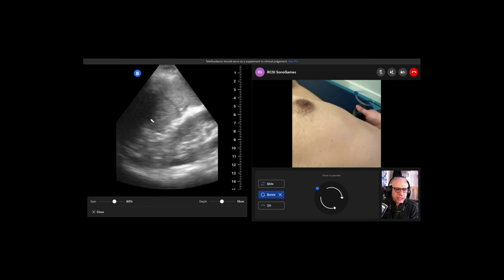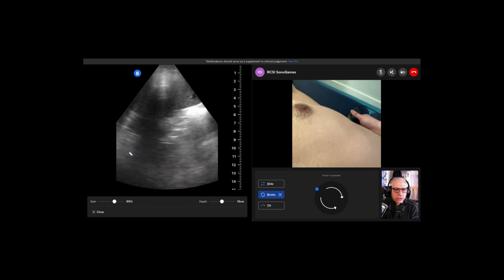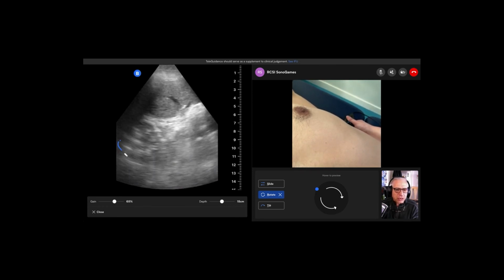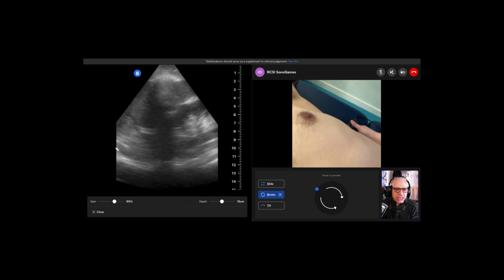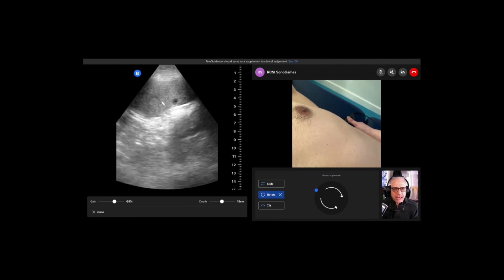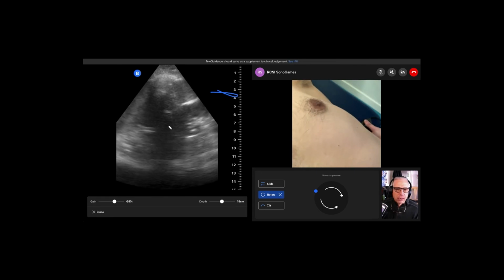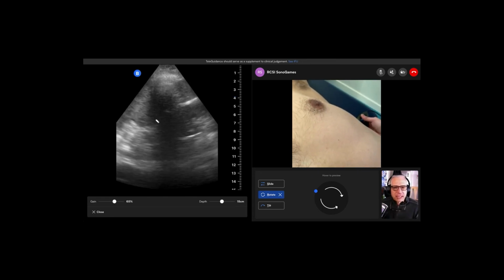And it can be challenging. There it is. Perfect. There's diaphragm. You just had a beautiful view. See if you can get back to that. I just slid right there. That's where you want to anchor your hand, because now you're seeing right here is spleen and diaphragm. That's where you're going to see blood. You're going to see blood here, or you're going to see blood by the paracolic gutter over here. You often do not see blood between the kidney and the spleen.